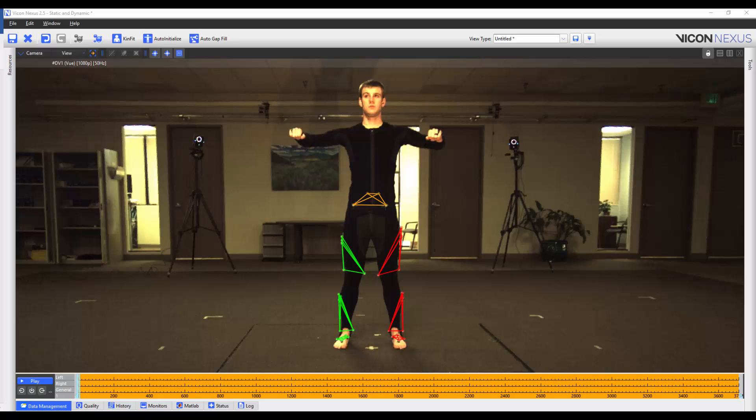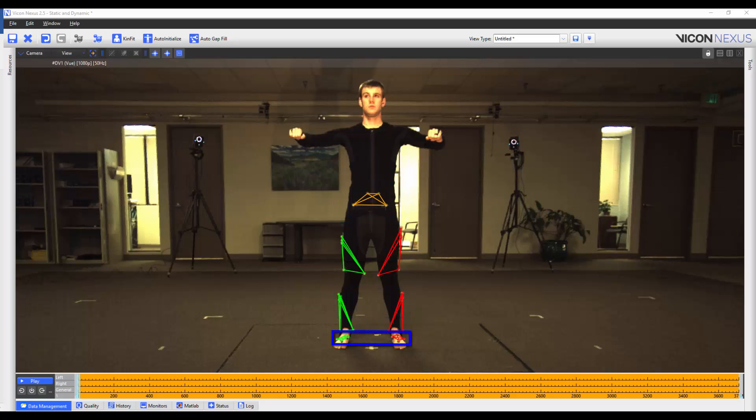I could create a VST for the full body, but for the purposes of this video I'm going to focus on the lower body only. The first thing we have done is we have placed four marker rigid body clusters onto our subject segments. These segments are the pelvis, the thighs, the tibias and the feet. We've also placed markers on the medial and lateral ankle and knee joints.